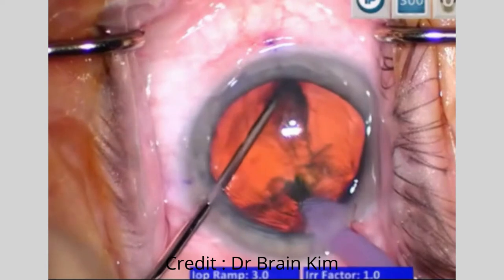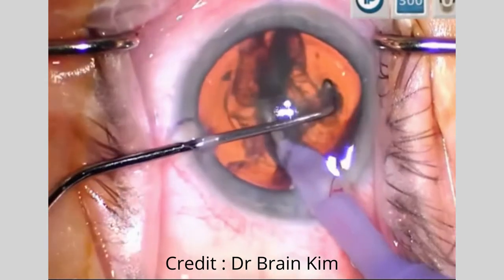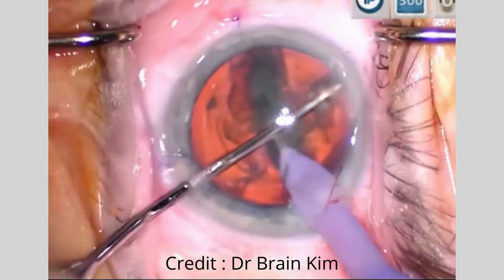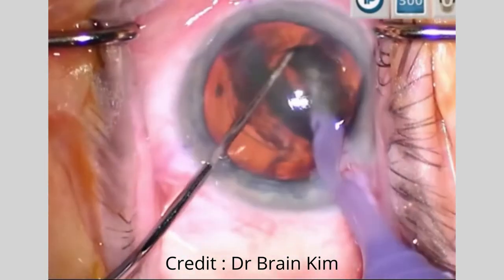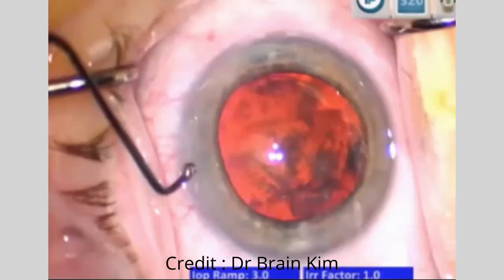The phaco tip is within the anterior capsule opening, and I dive down into the epinuclear material. I know that I'm outside of the endonucleus but at the same level. I'm bringing the two instruments together in the center, and the chop is initiated without difficulty. The cross chop uses the same maneuver of pronating and supinating the wrist, then bringing the chopper into the middle and fracturing.